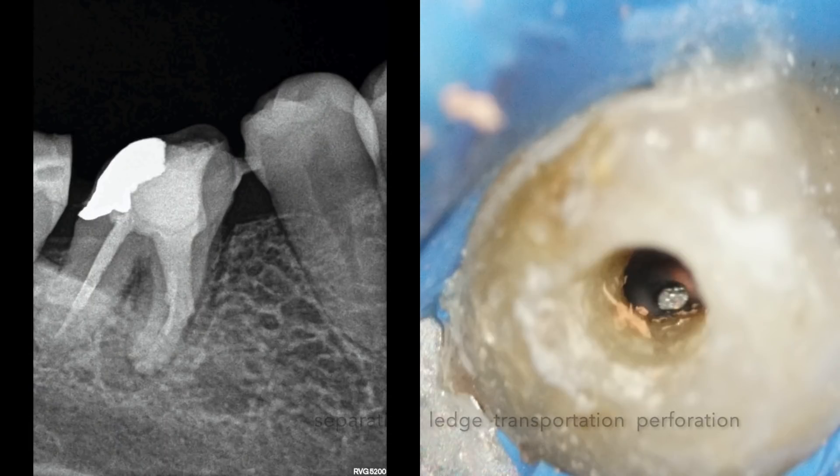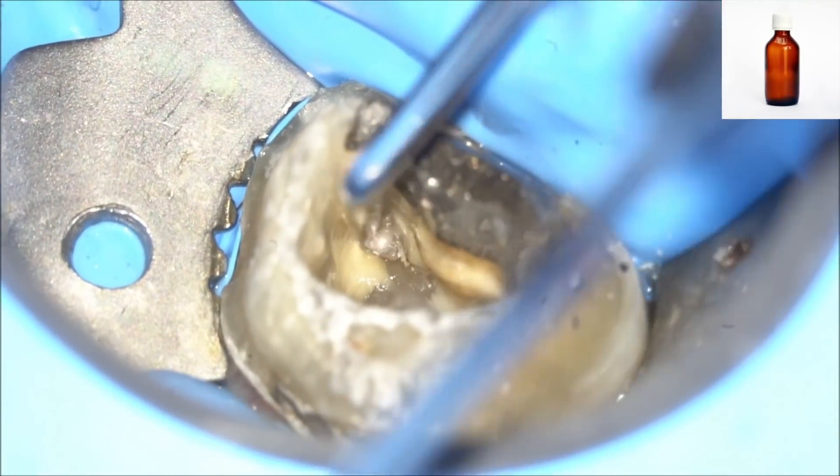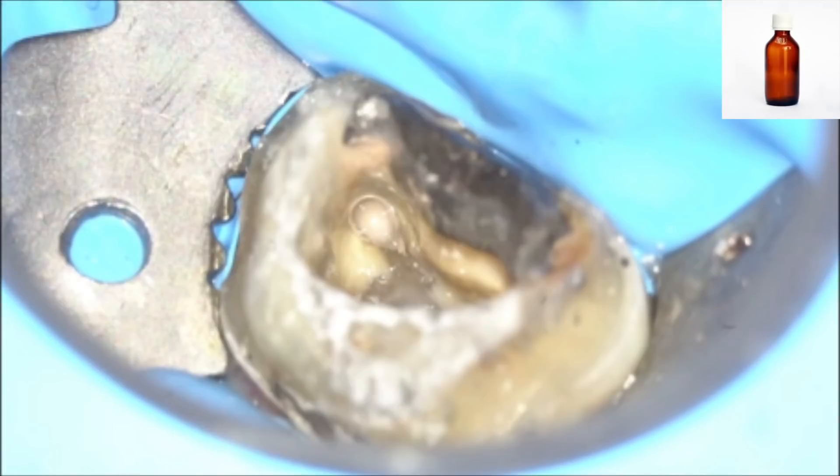So many times I encountered errors during Gutta Percha removal — instrument separation, perforation, ledge formation, or transportation of the canal. A very common method practiced by me, and maybe by you also, is to use some kind of Gutta Percha solvent to remove the Gutta Percha from the canal and to make the removal easier.